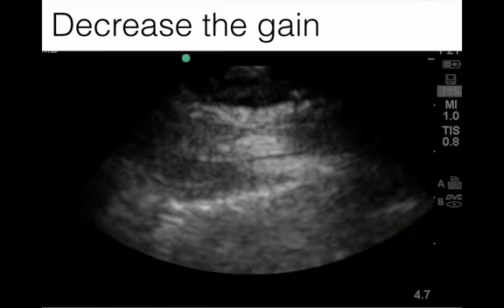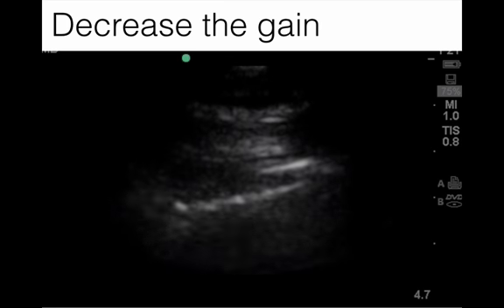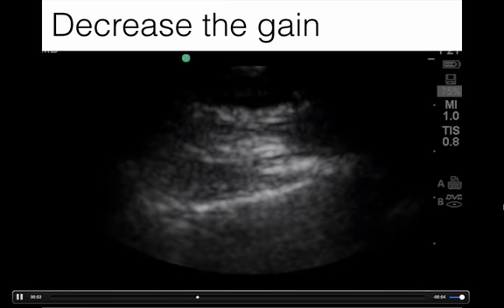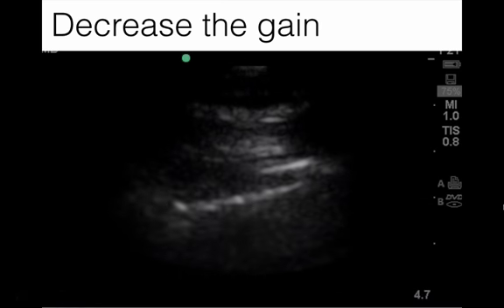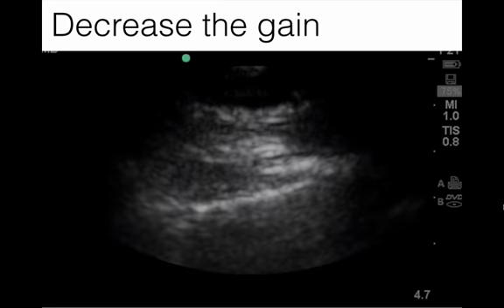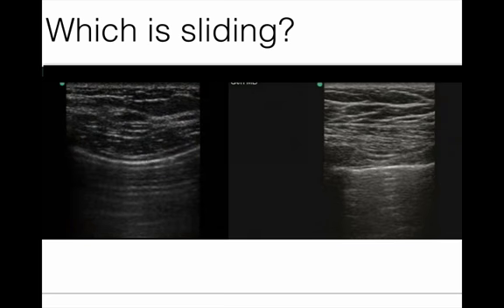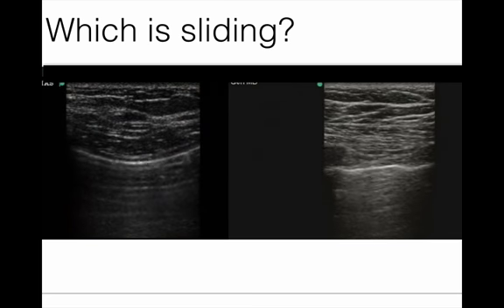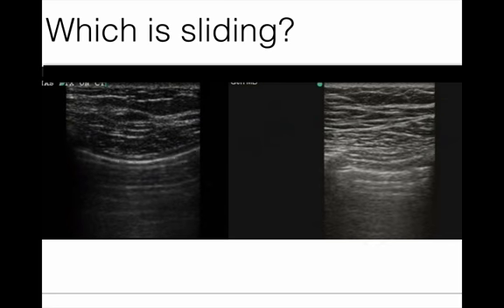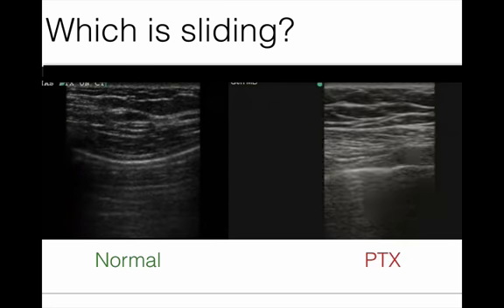The same thing can be done when you're using the phased array probe, and you want to make sure that you decrease the depth to basically 5 centimeters, and by decreasing the gain you can see much more of the sliding. So which side has sliding, which has not sliding? So this is actually normal, and we could see on the right there's no lung sliding, so this is a pneumothorax.